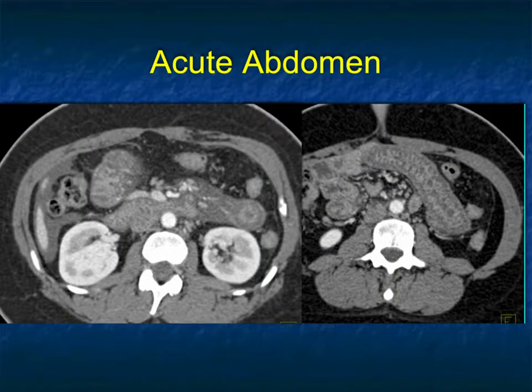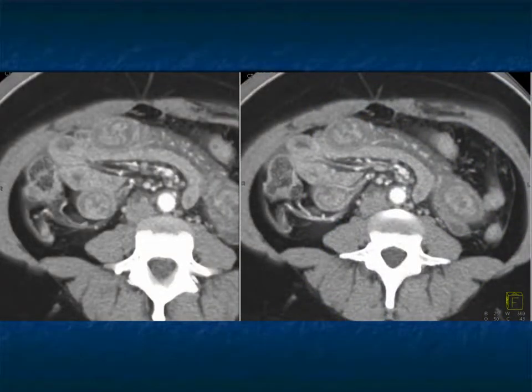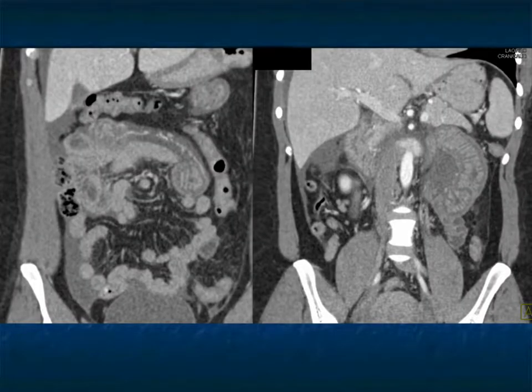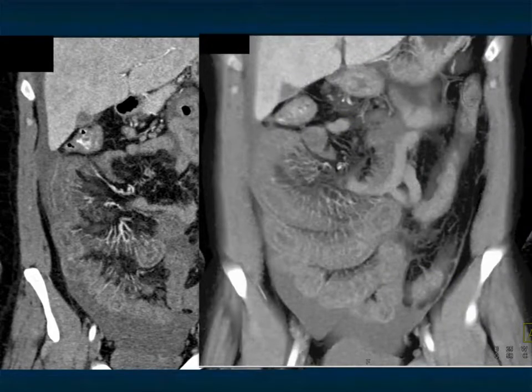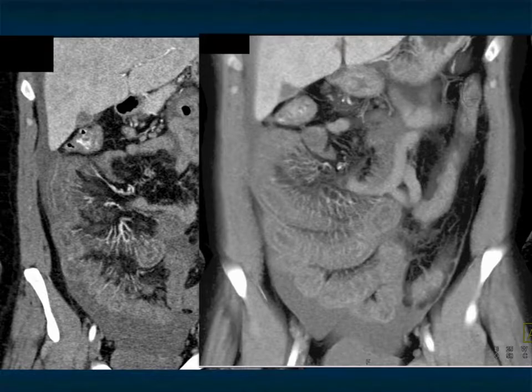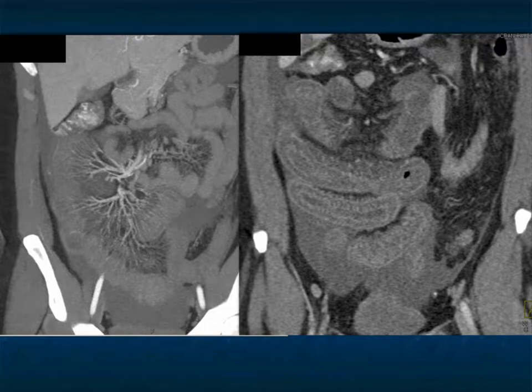Another example: look at the markedly thickened bowel, the edema. You can go through your differential of infectious, inflammatory, ischemia, radiation — all of those things you want to think about. There's ascites present as well. The patient is presenting with an acute abdomen; the question is should we go to the OR? But when you get the history, the patient started lisinopril 24 hours earlier. You simply give the patient fluids, support the patient, stop the medication, and within 24 hours the patient is back to normal. So a very, very critical diagnosis.